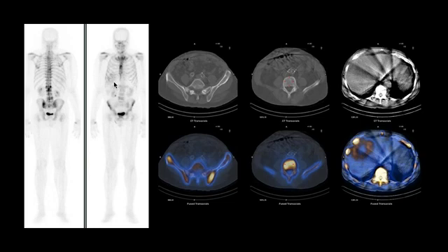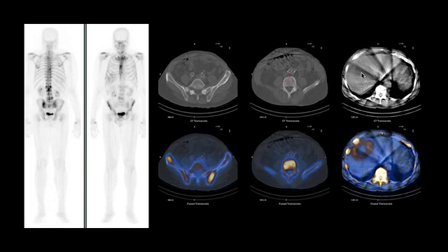If you pay attention to this whole body image in the anterior projection, there is some uptake in the right upper quadrant in the region of the liver. On the SPECT CT, we found this large mass incidentally — which was not known before in this patient — seen here on this fused SPECT CT image. This turned out to be metastatic disease from a second unknown primary, which was lung cancer. So SPECT CT provided a lot of useful information in this patient's management.